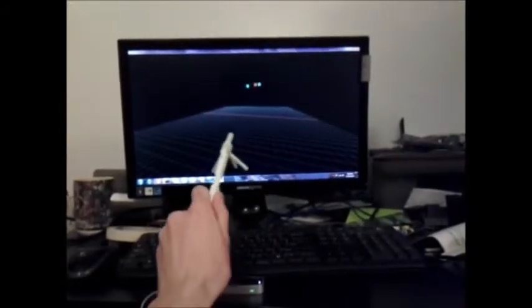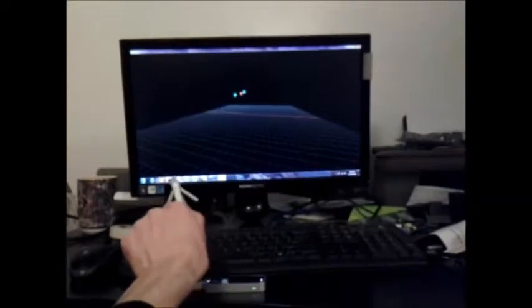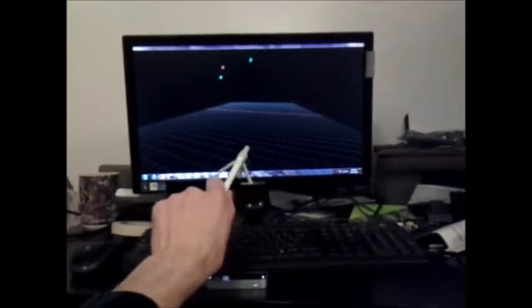We're not moving forward with this method since having to account for all 3 attachments simultaneously is not very robust. If the leap motion controller cannot see all 3 attachments, then the tracking fails.